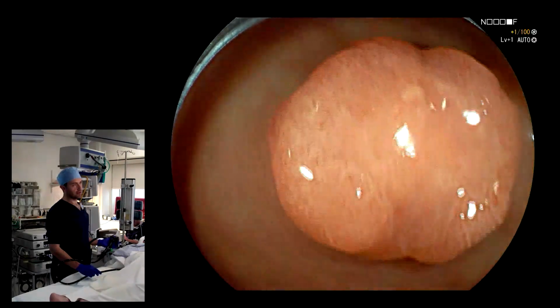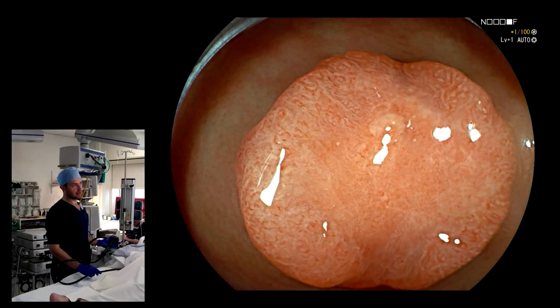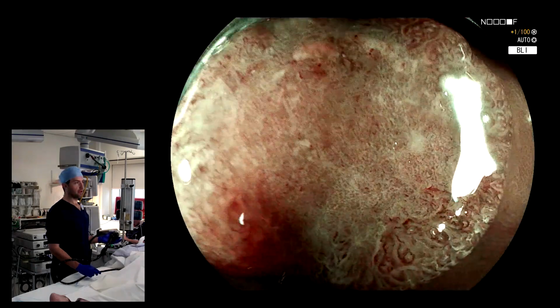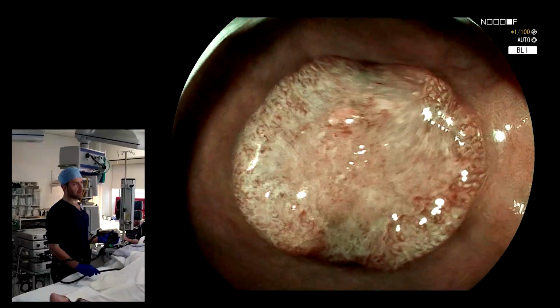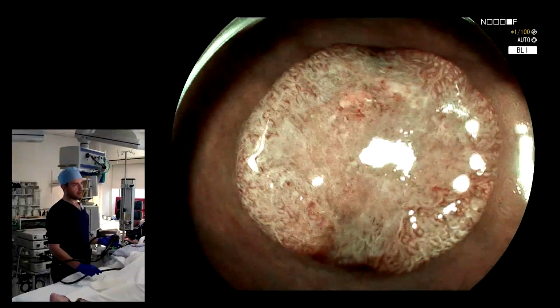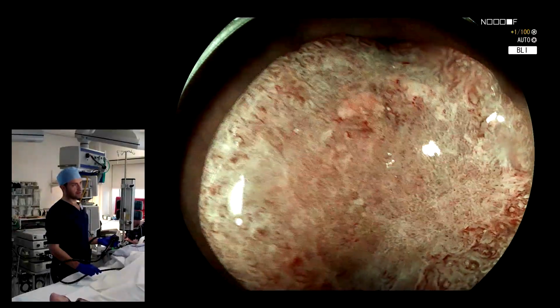And then as we go closer, we can nicely in white light firstly see that demarcation line here. And then if we go for narrowband or virtual chromoendoscopy or BLI, as we are in this case, or i-scan if we're talking about Pentax, then in this case BLI beautifully shows us that demarcation line.